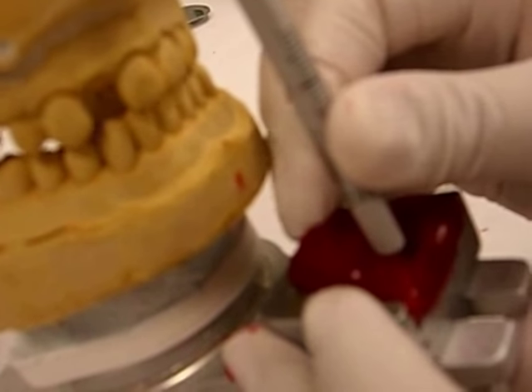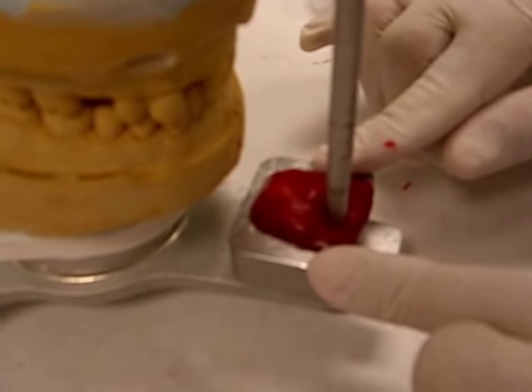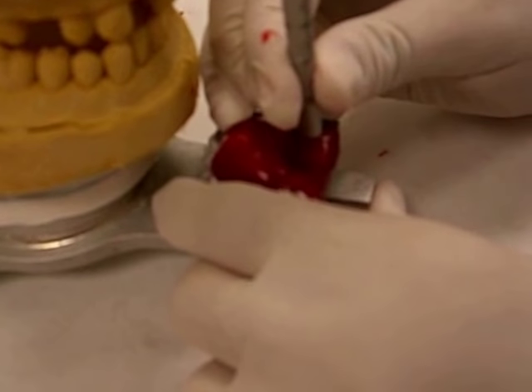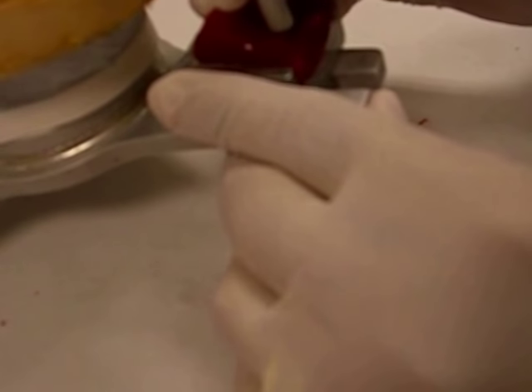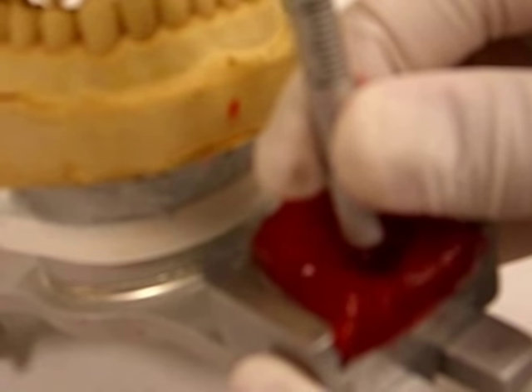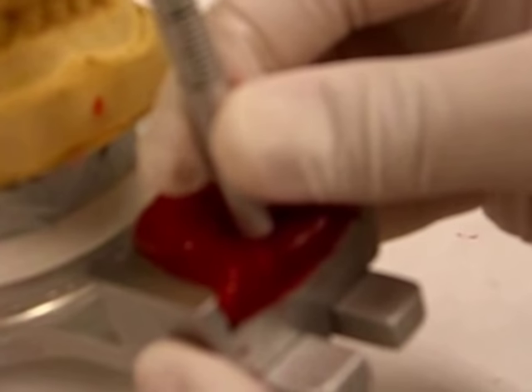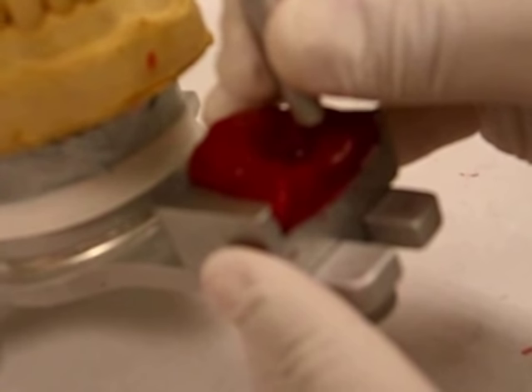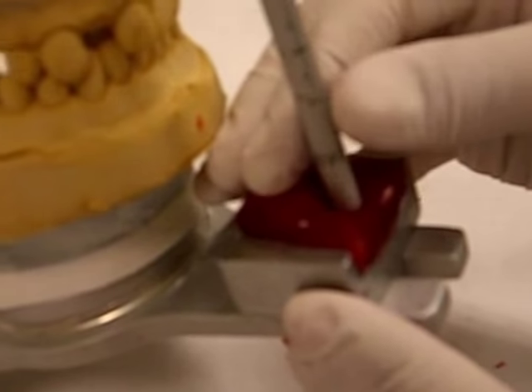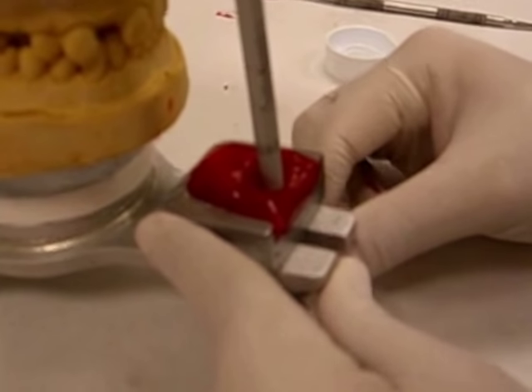The anterior guide table should be able to limit my movements. It shouldn't allow me to go past that tip to tip on the canines or past the edge-to-edge position in protrusive. This is already set — just be careful because it's extremely hot. It stops right there. This is going to help me determine the length of my central incisors when fabricating the prosthesis, as well as the length of the canines and the lingual surface of the canines that are going to give me the guidance for the prosthesis. When you go into protrusive, you have posterior disocclusion — so we have mutually protected occlusion.